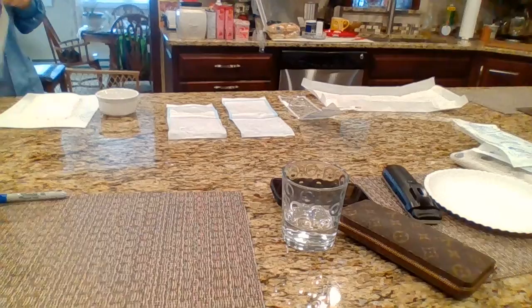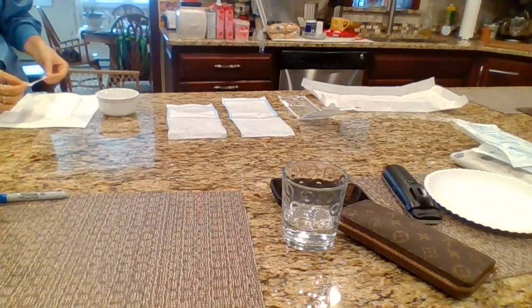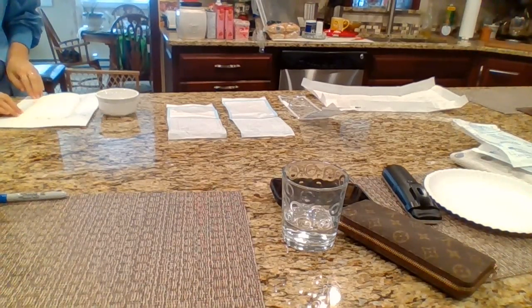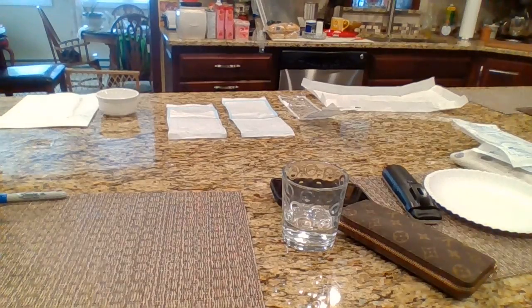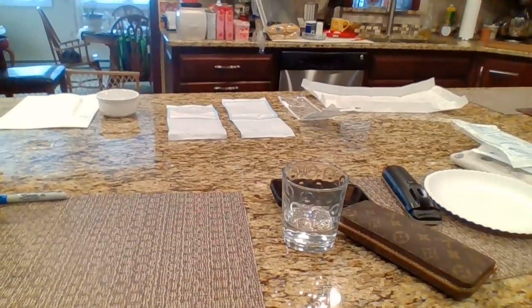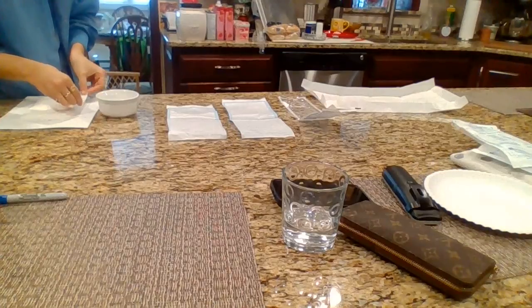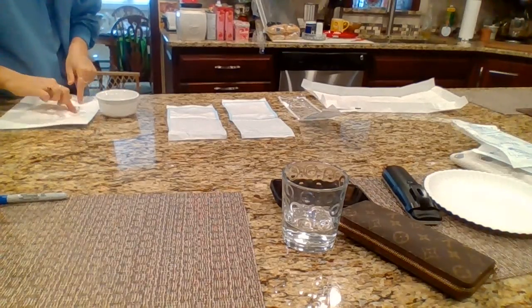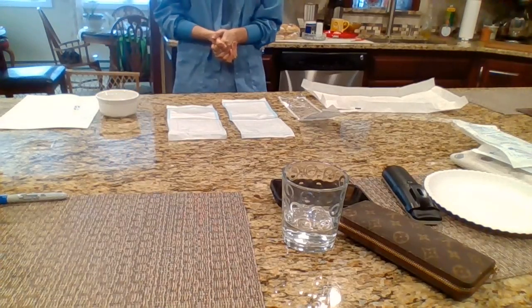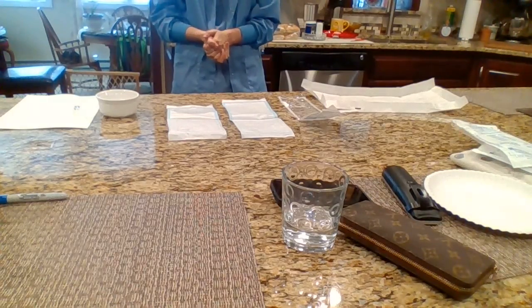Okay, and like I was saying in the beginning of the video, I had to label that one piece of tape, which would be the last step, so we're ready to grab that. So I'm gonna go over here and get that. I'm just going to stick it over the side. So now everything is complete. The wound is taped up, the initials, date, and time are written down.